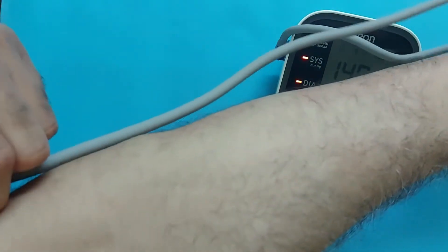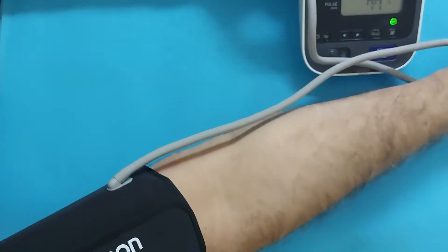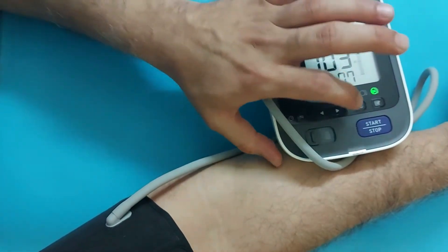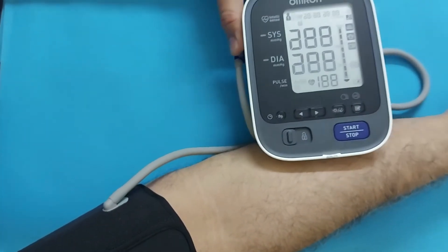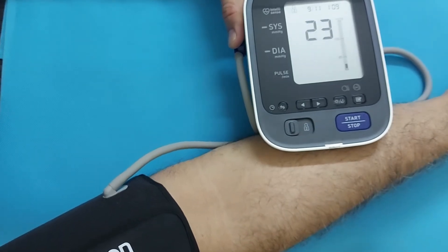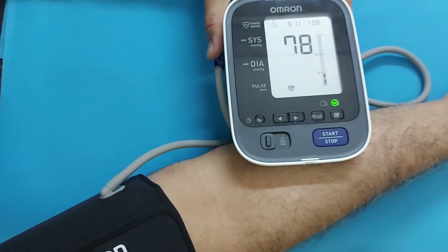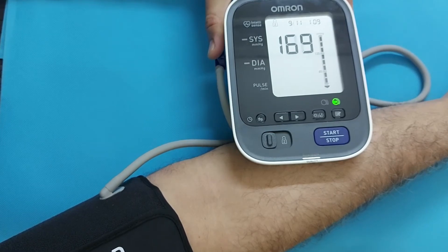For the right hand, the technique is different. The tube should be on the inner side of your hand, not in the middle. Now press the start button and the blood pressure measurement will start. Blood pressure results for the right hand and left hand can be different — sometimes the left hand side blood pressure is higher. Discuss with your physician and they will explain whether to measure with the left or right hand.